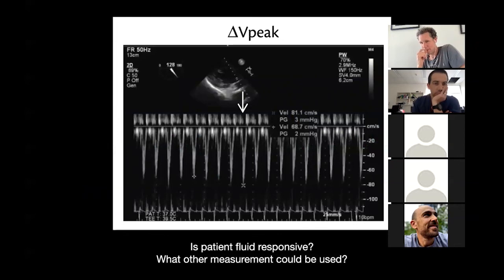It's because of the interventricular dependence. The pericardium is common and the septum is shifted to the left. Every time you give fluid, the RV dilates, reducing the cardiac output on the left side. So one of the big problems with this measurement is that with RV dysfunction, you can get false positives, swings in the blood coming out of the left ventricle.